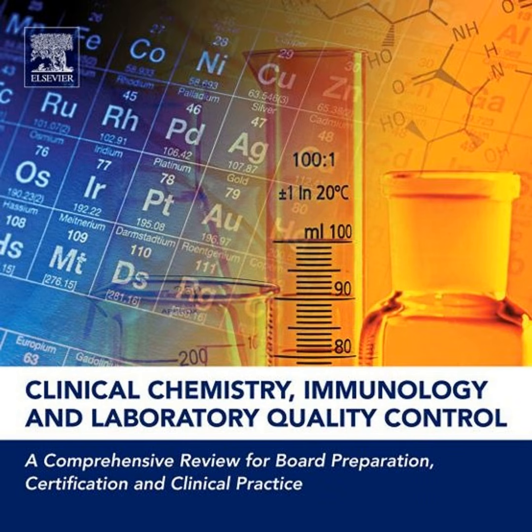Now, if the analytical phase has its pitfalls, the pre-analytical phase is a minefield. It is. The vast majority of laboratory errors, the non-cognitive slips and lapses, happen before the specimen ever hits an analyzer. And the single scariest pre-analytical error? Incorrect patient identification, without a doubt. The one that keeps lab directors up at night. That's why we have to match at least two criteria like name and date of birth every single time.